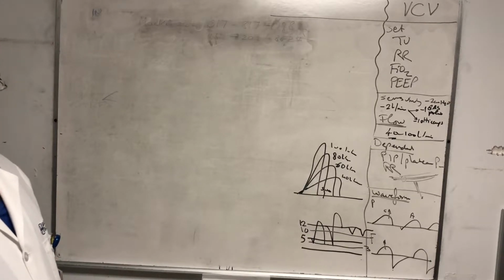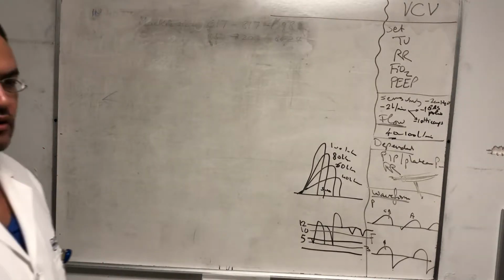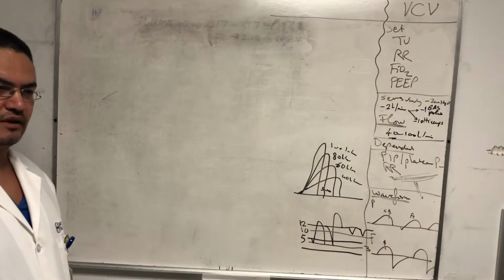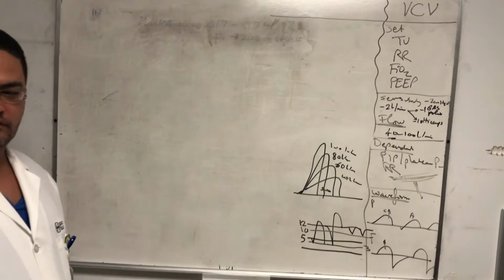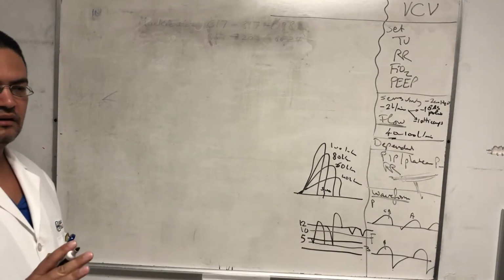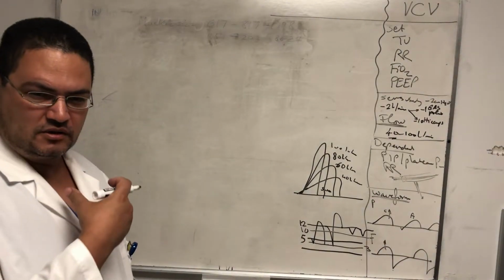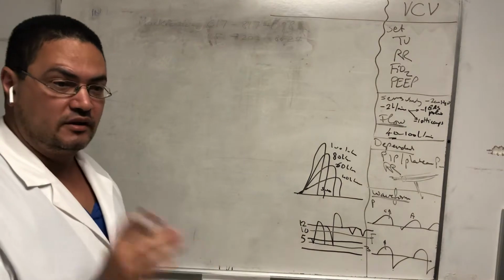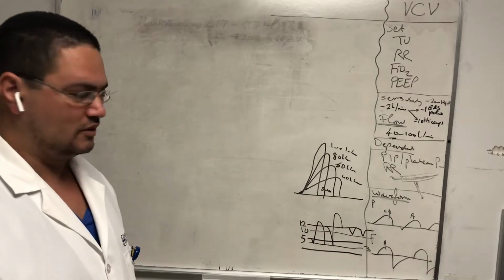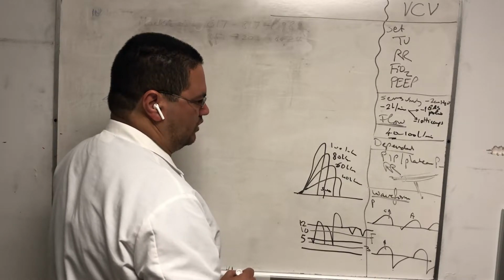Sometimes you want to reduce the inspiratory time, if somebody has asthma or something like that. Yep. So that's one of the two big reasons to do that. One of them is the patient is asthmatic. I can't take all the time for inspiration and leave him no time for exhalation, so let's reduce the time. Number two is air hunger. Air hunger is when the patient does like this, moving all the accessory muscles of inspiration every time the breath is being given. That shouldn't be, right? Why are you taking a breath when the breath is being given? That is not normal. So that's why they do that.